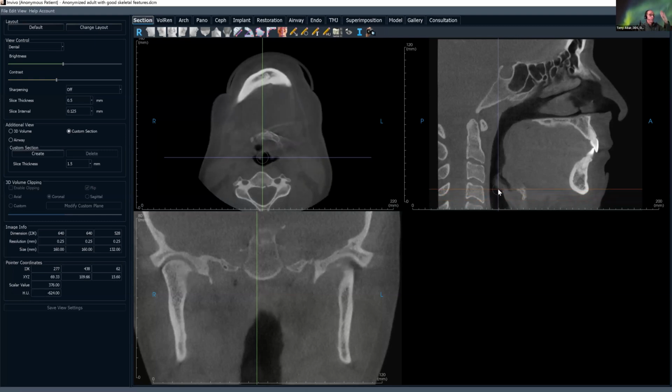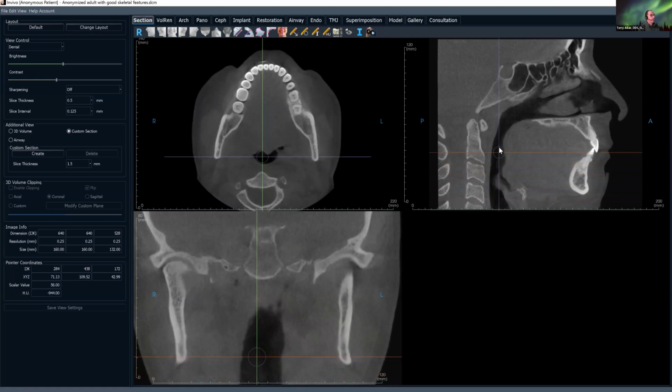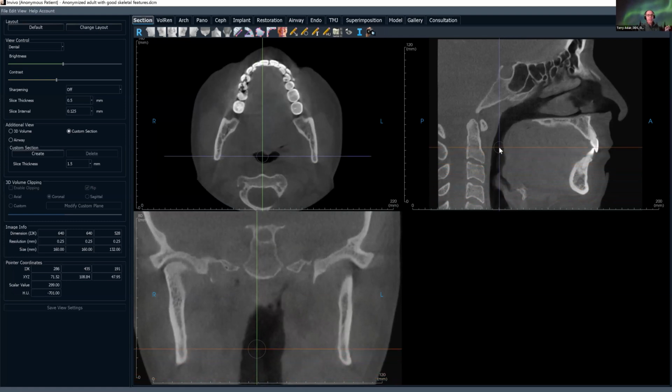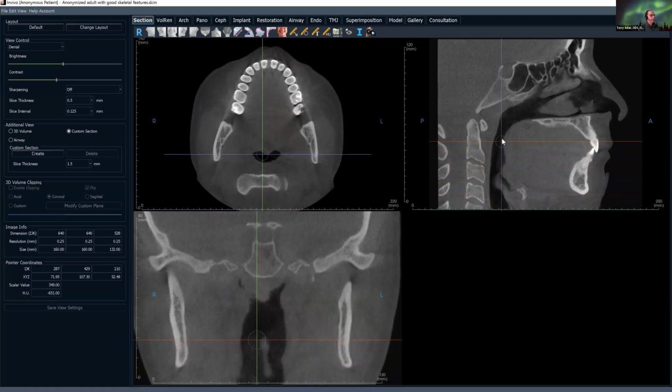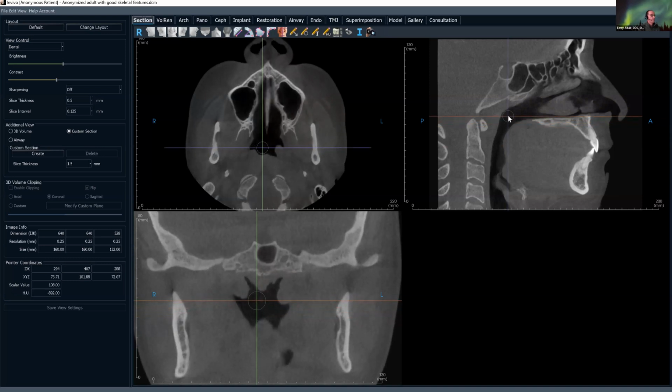So now I'm just scrolling superiorly. Again, here's a transverse foramina. I'm looking at the lamina to make sure that everything's intact here. Scrolling superiorly, again, transverse foramina on C3. Now, C2, which we are at right now, odontoid, atlas and axis have their own unique anatomy, but they still have this foramina. I'm going more superiorly. Now we can see the tip of C2 right here. Here is the arch of C1. And I go to the very top here, right here.